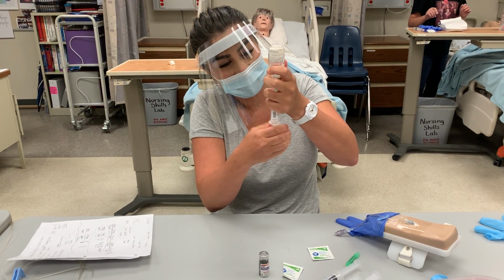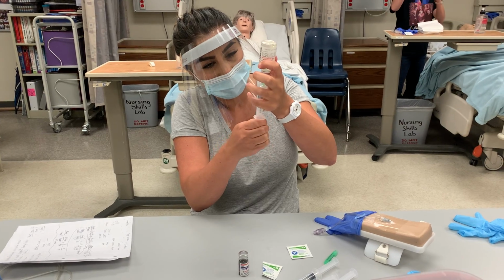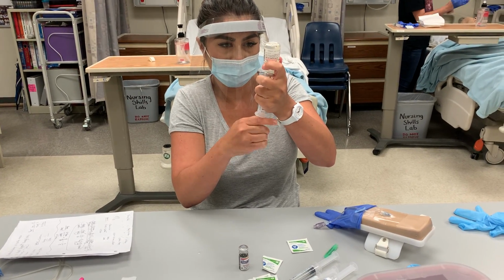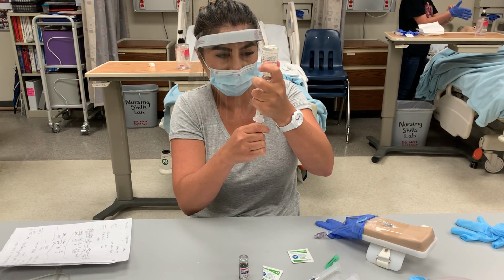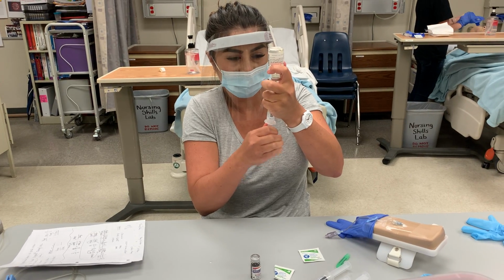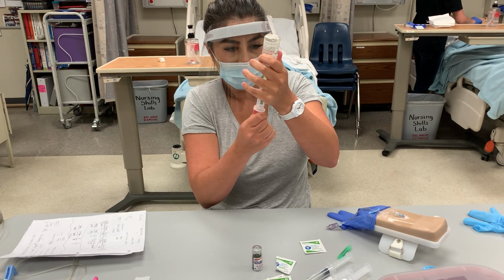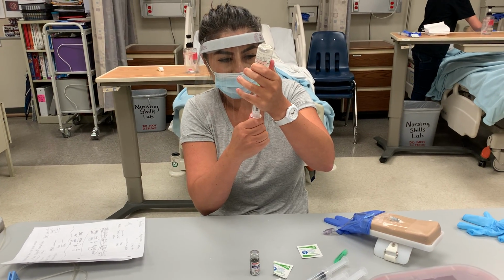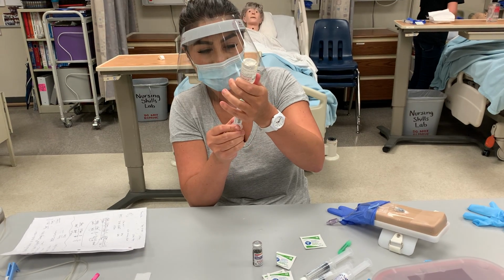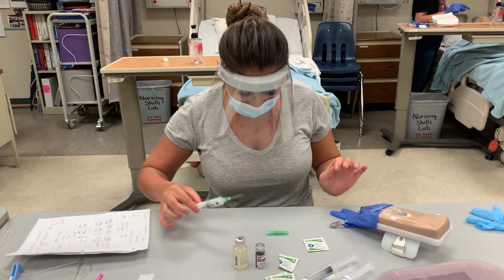So now I'm going to put a mask on myself, and I'm going to put gloves on. Okay. Almost. There's a lot of resistance because these have been used. Okay, I got the 6 mLs. Okay, so I'm going to go ahead and recap that.